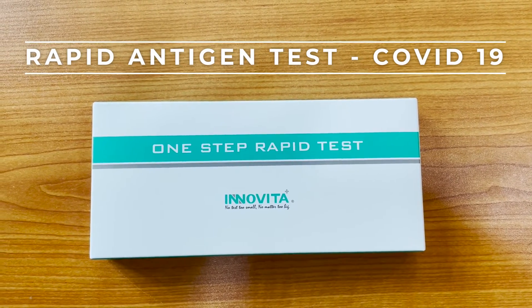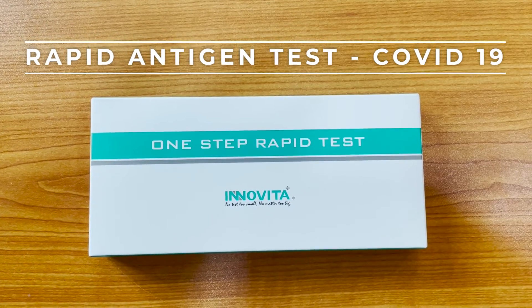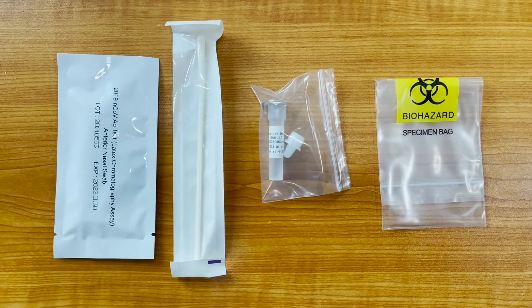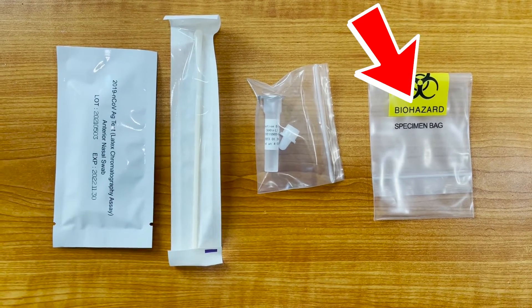Today I have to do a rapid antigen test for COVID-19. Inside the box there is the test kit, a nasal swab, a reagent, and a specimen bag to store your test in.